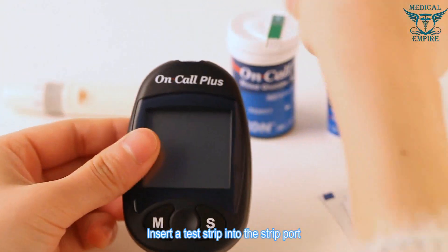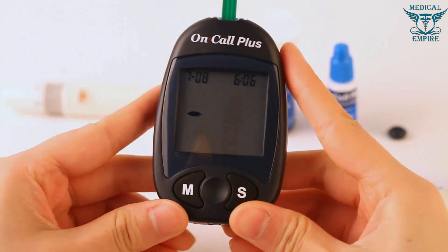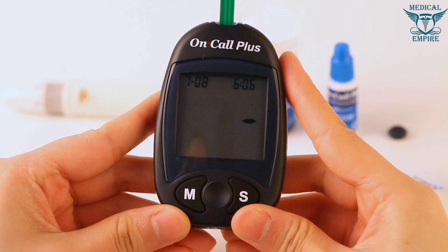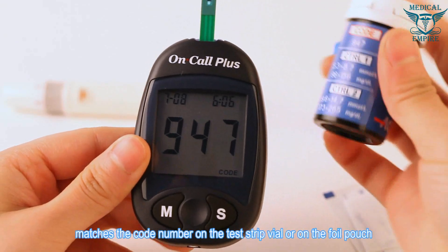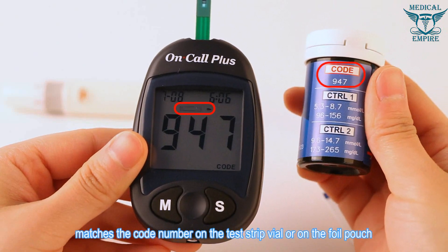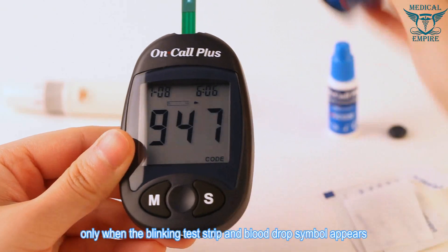Insert a test strip into the strip port to turn the meter on and check the display. Make sure the code number on the display matches the code number on the test strip vial or foil pouch. The meter is ready for testing only when the blinking test strip and blood drop symbol appears.